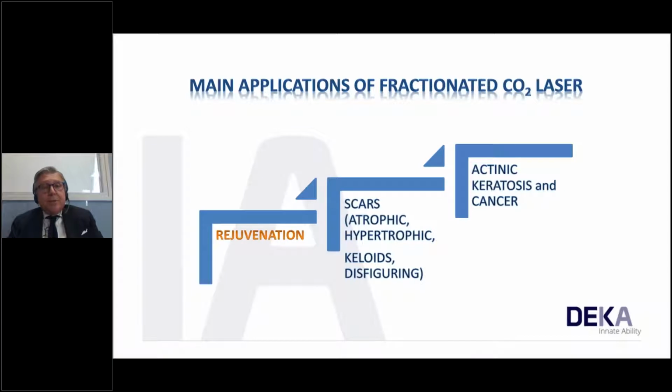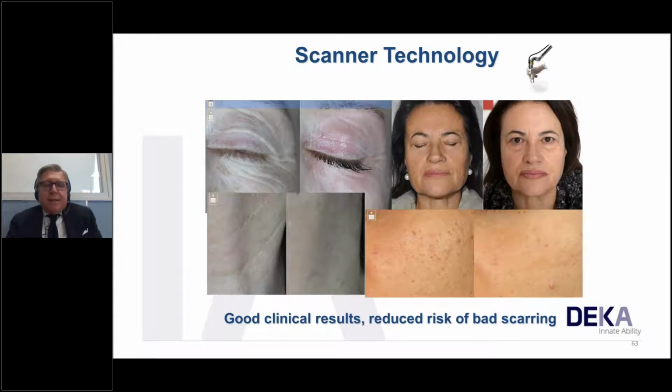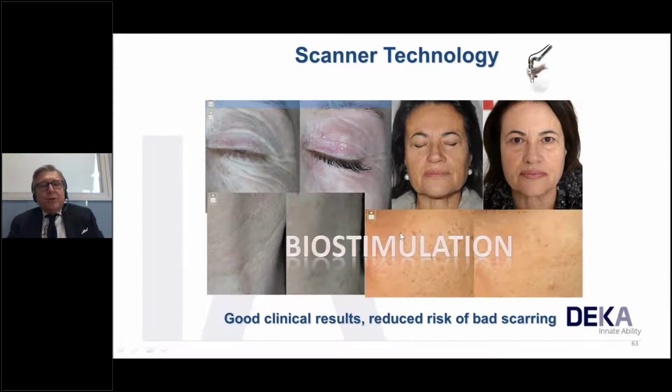And so the main applications of fractional CO2 laser are rejuvenation, treatment of scars with atrophic, hypertrophic, keloids, and disfiguring scars, and actinic keratosis and cancer, non-melanoma cancer, of course. This is at a glance the good clinical results that we can have with this clinical indication. Why? Because we biostimulate the skin with a fractional.